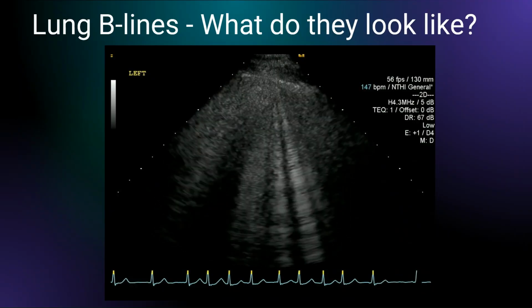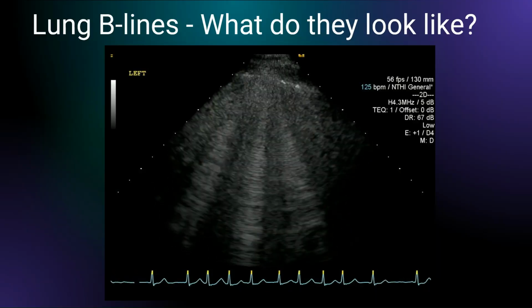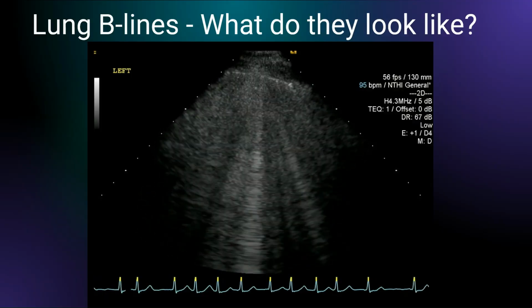This is just a left anterior view here, and we can see these various lines spread throughout the picture. And just a few more there.